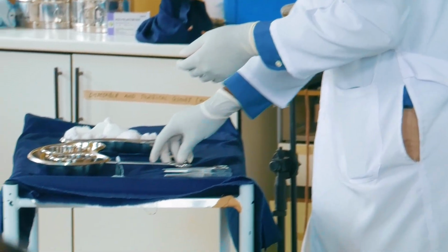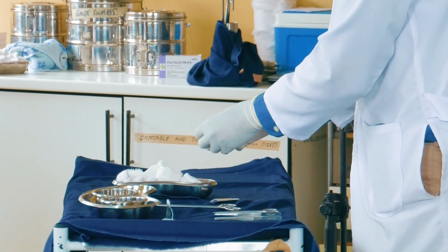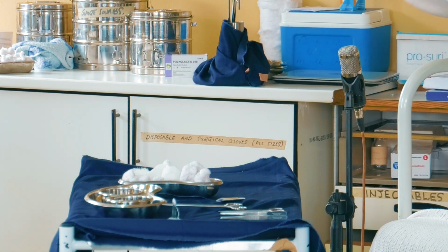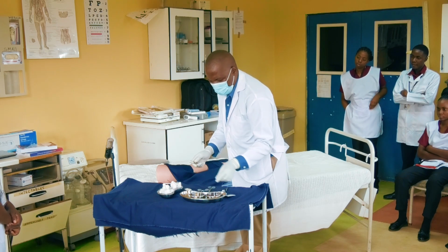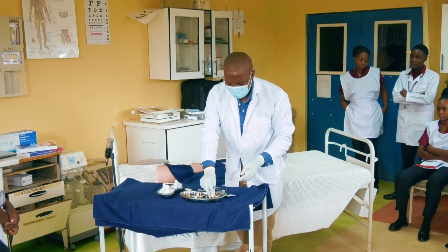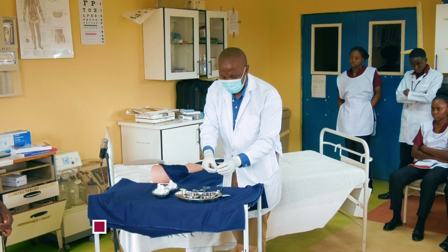Of course, wound dressing we said should start. Just for the sake of me feeling that I don't want to start touching here with this glove, I may just use one simple method. This one can be used like that, but that's not what you do when you are doing the simple suturing.